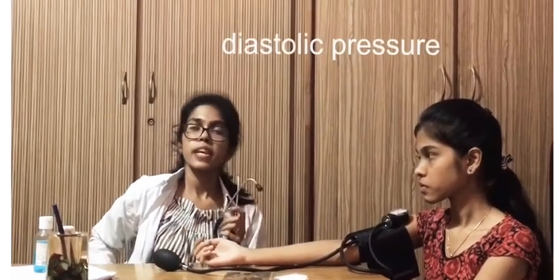Now let's take the diastolic blood pressure. For taking the diastolic blood pressure, make sure the ear buds of the stethoscope are facing the opposite side of you. Place the bell of the stethoscope on the brachial artery and feel the pulse. Now inflate air inside the sphygmomanometer.